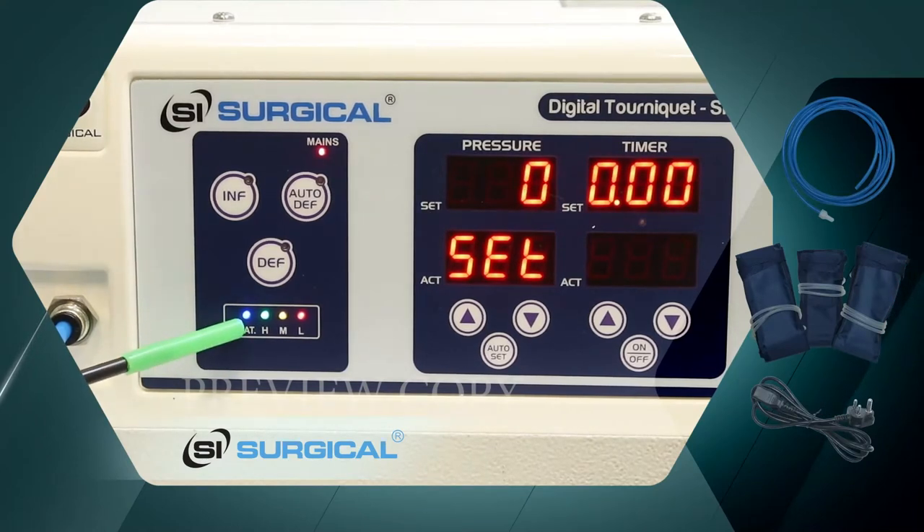This is the battery indicator. Green is high, yellow is medium, and red is low battery.